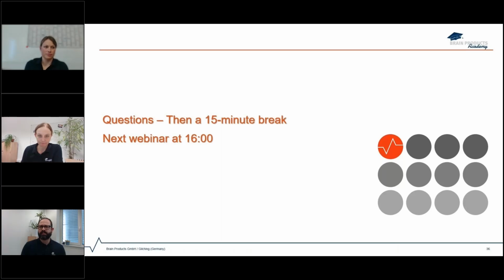So talking about the artifacts coming from the scanner, right? Yeah, those definitely, like all other pipelines that we have in Analyzer, you can automate them. You basically do this analysis once manually. And then it's, of course, important that the parameters that you input in this analysis are the same across recordings, which would usually be the case. And then you can, in Analyzer, use the history template in order to automate this across different recordings. So there's definitely some automatic part here.